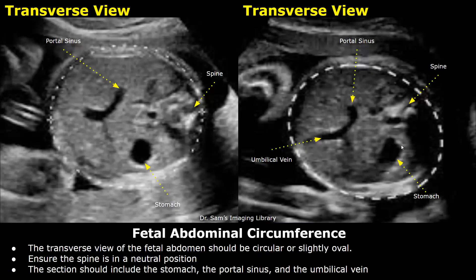The transverse view of the fetal abdomen should be circular or slightly oval in shape. Based on the fetal position, the spine can be seen in a three o'clock position, six o'clock, or nine o'clock, and sometimes in a twelve o'clock position.